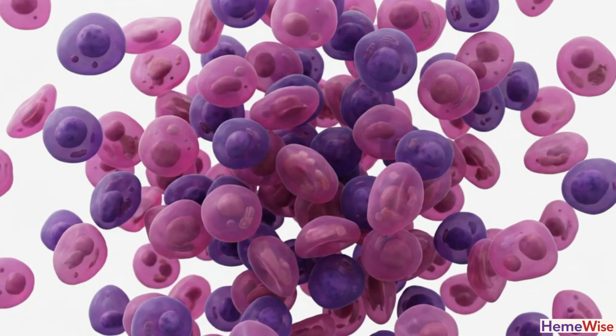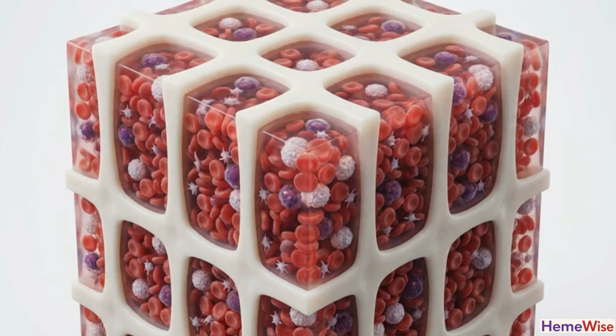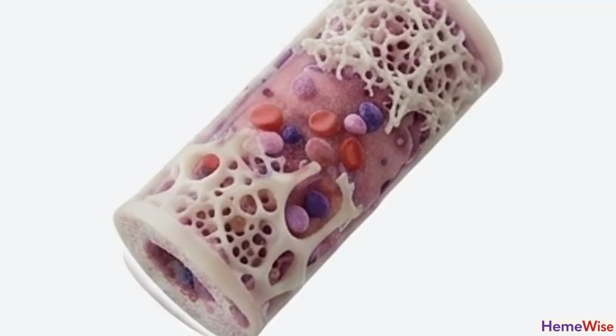While the aspirate provides cellular resolution, it lacks spatial context. To see the distribution of disease within the bone, we must examine the solid core. An adequate trephine core should measure at least 1.5 to 1.6 centimeters. This length is required to include enough intertrabecular space for a representative assessment. Short cores increase the risk of sampling errors.